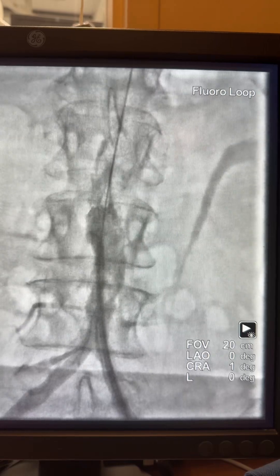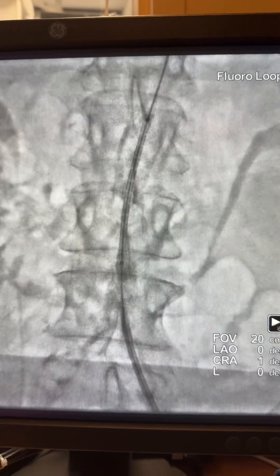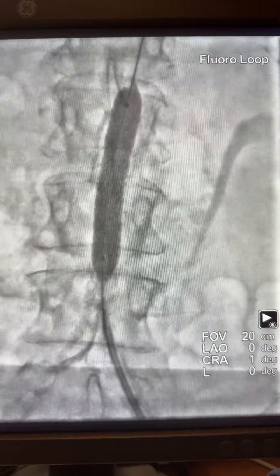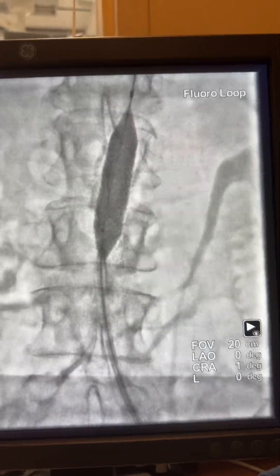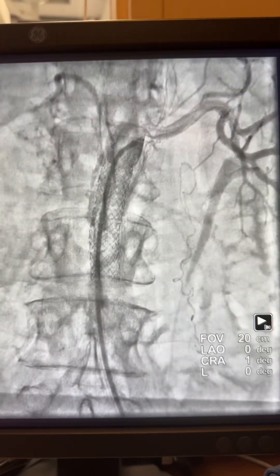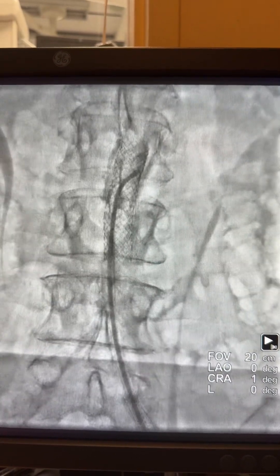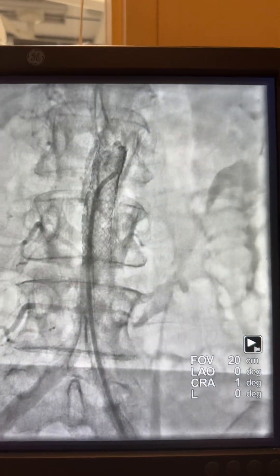With the 8 French sheath in place, it's advanced up to that segment and the stent is placed. The stent was expanded very well. I then post-dilated using a larger balloon. Here is the catheter advanced with a nice waveform, nice pressure, and nice results. More injections proximally and distally confirm excellent final outcome. Thank you very much, I hope you enjoyed this case.